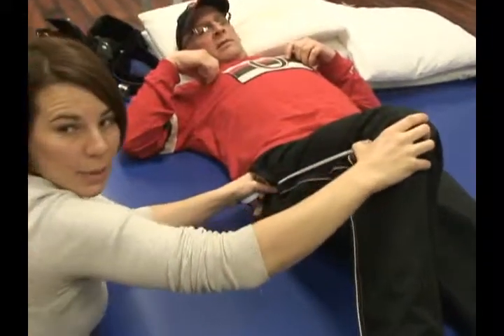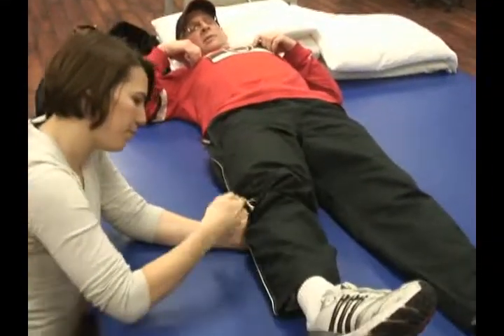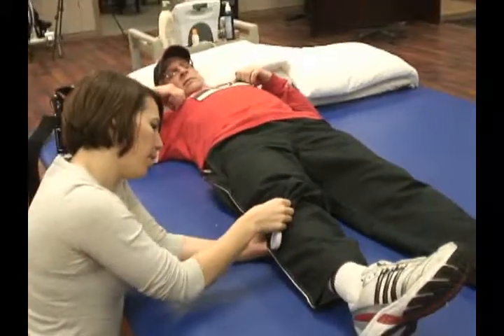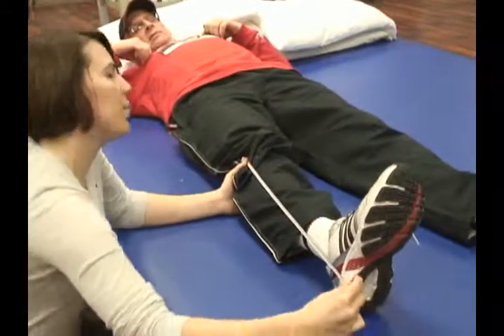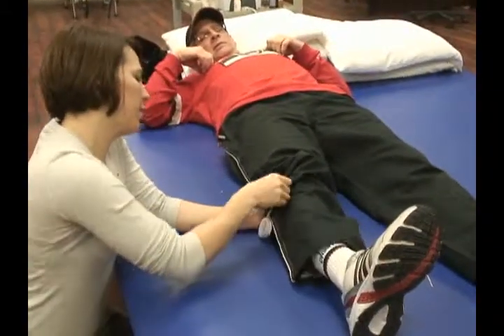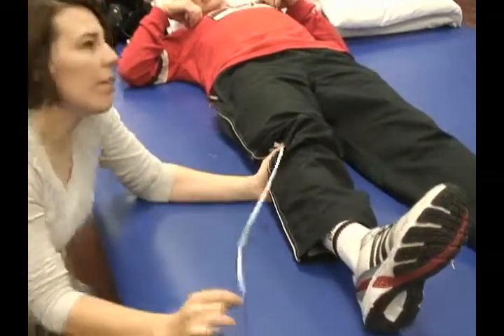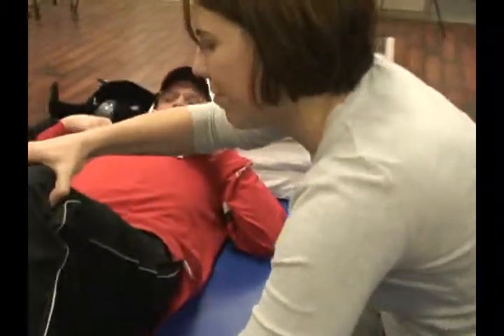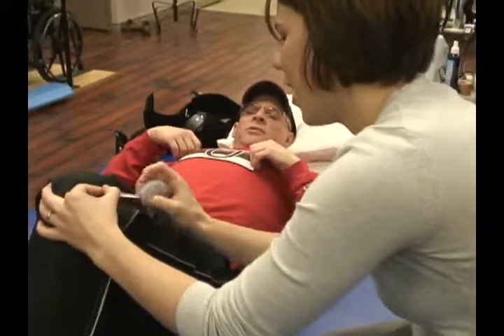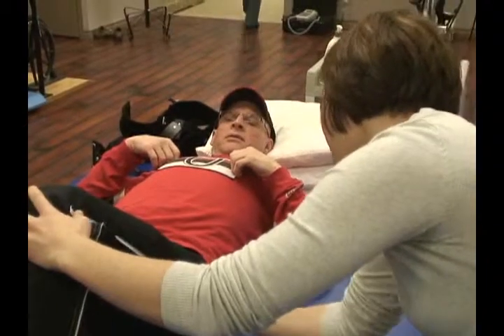So 43 centimeters. And your lower leg is 55. So you measure the length of the femur? Yeah, and the length of the lower leg as well — basically your tibia.